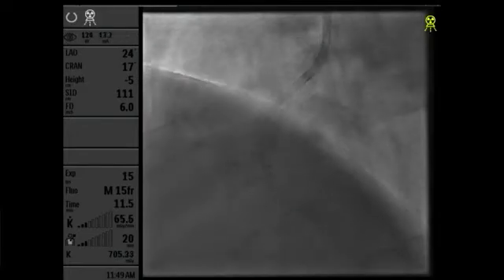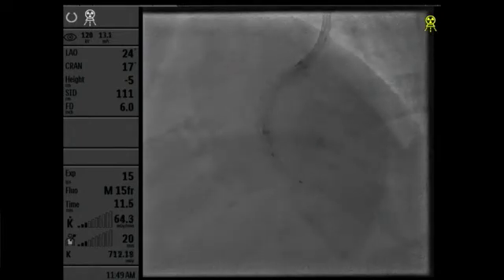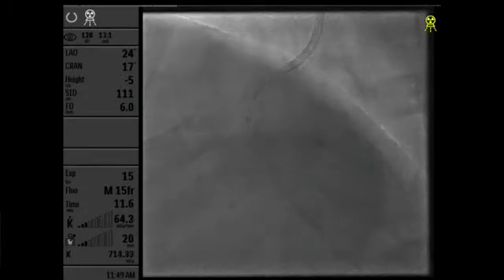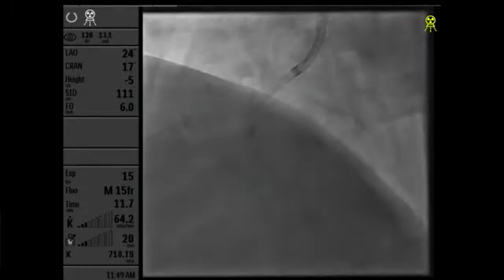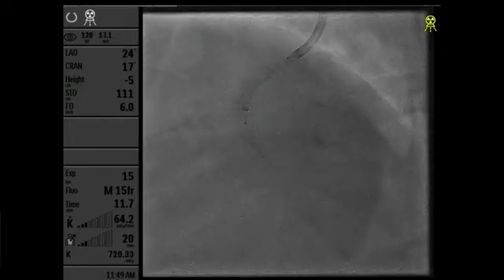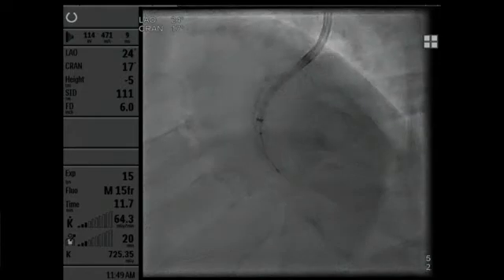We were at the distal edge of the stent. I'll bring back a little. I don't think you need to push it anymore. No, I think we're going to pull back a little more, just a tiny bit. Come back a bit further, because it's right on the edge of the stent. Put the middle of the balloon. Don't go back too much, I don't want to lose it. There we are. That's fine. That's good. I think we're in good shape here. Good. Okay, let's go up. Perfect.